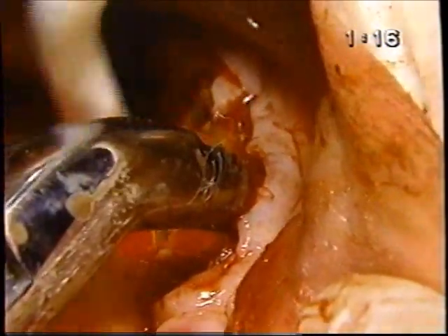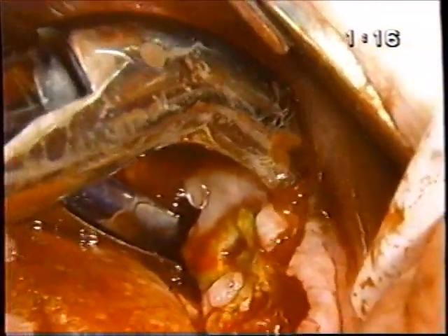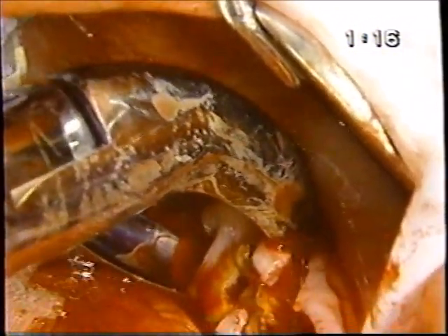Okay, we're going to try a long shot here. We've got that bombed out second molar. We're going to try with the forceps, not knowing if it's going to work or not. It could just mush out on us here. We've got some infection. We might need to use interligamental. Let's see what we got there.